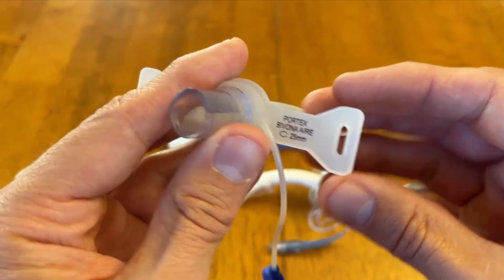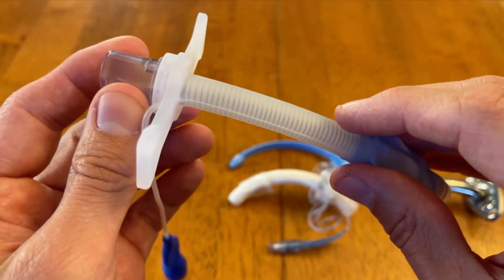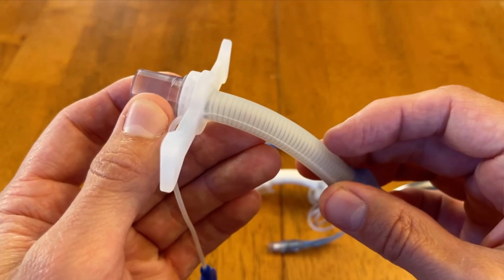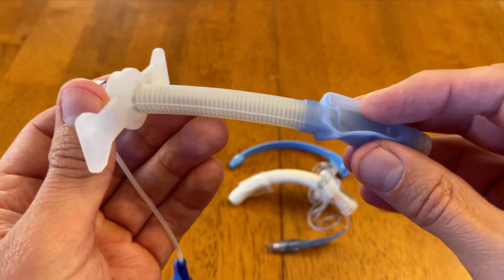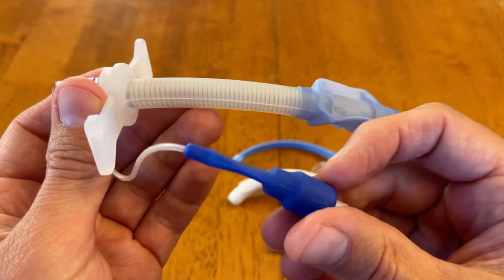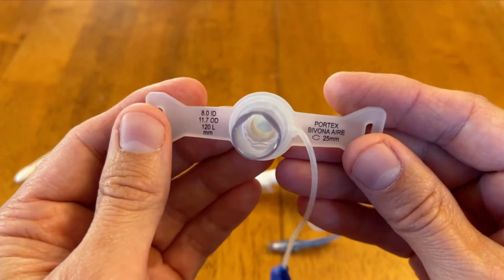The next thing is, if I turn this sideways here, you'll see this is considered the shaft of the tracheostomy tube, and this can come in different sizes depending on, of course, the size of your patient's neck and fitting them. The other thing you'll see more distally here is my cuff and the pilot balloon that goes with that to inflate that. And that's a really important feature to notice right away.